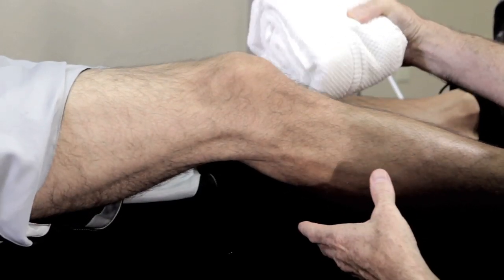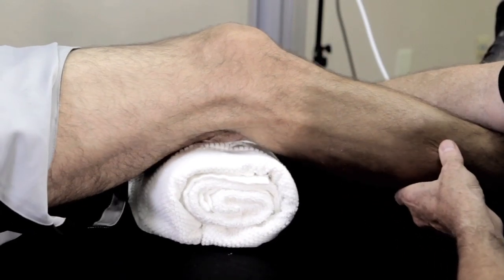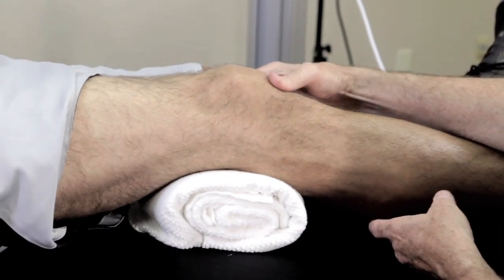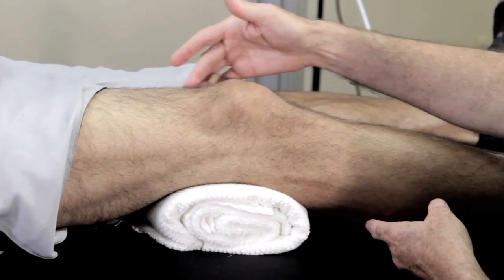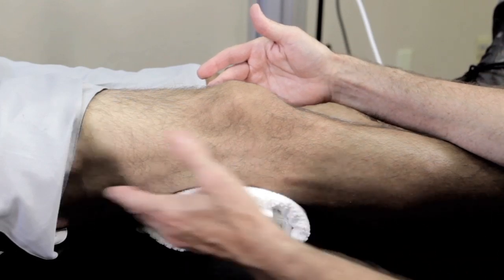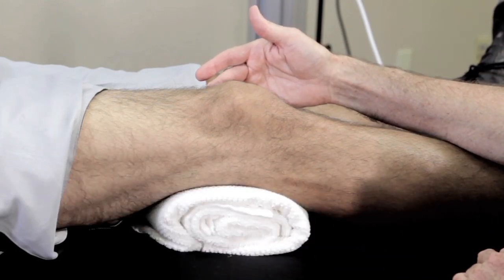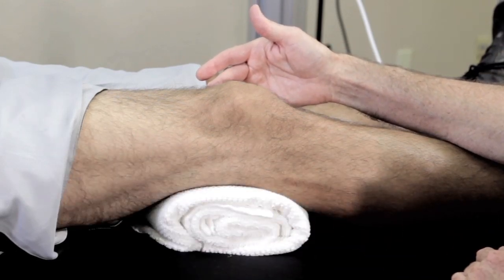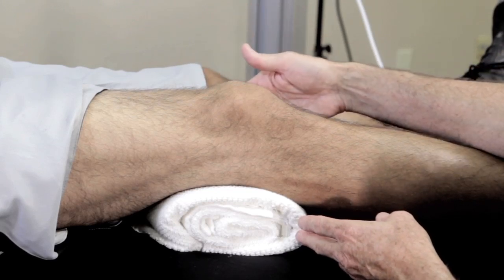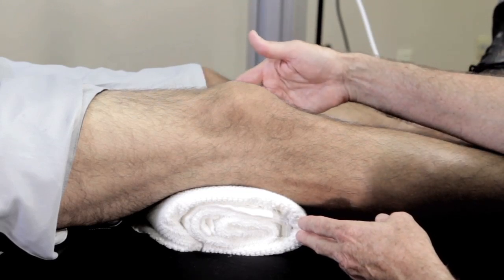The most common image initially done at the onset of a knee examination is to evaluate the structures in the suprapatellar region. The patient is positioned in a supine position, with a towel under the knee to apply some slight flexion and keep it from locking out in full extension.